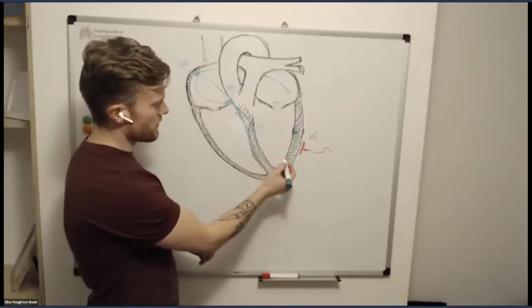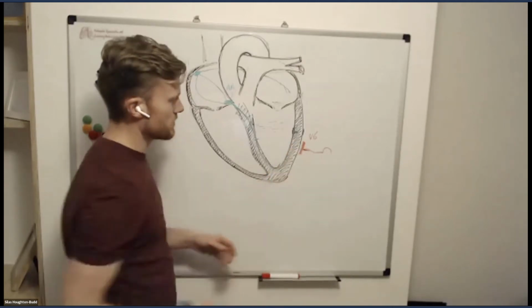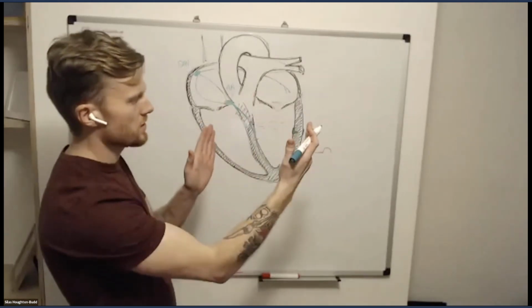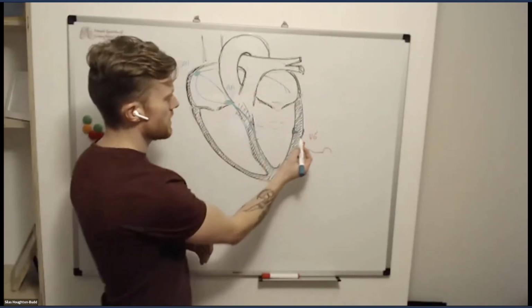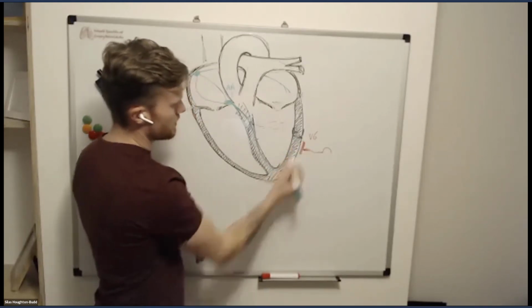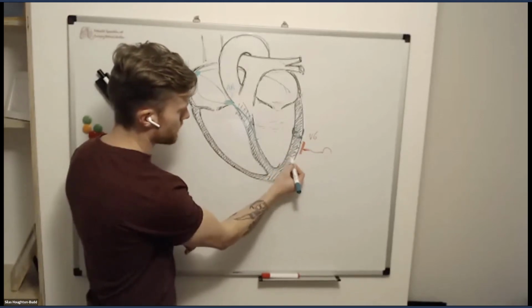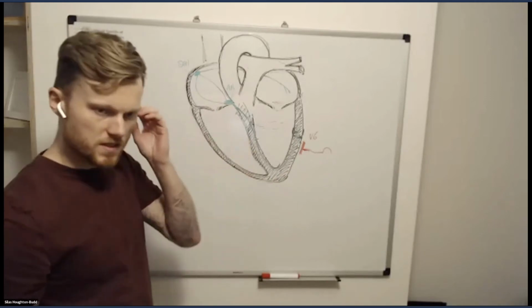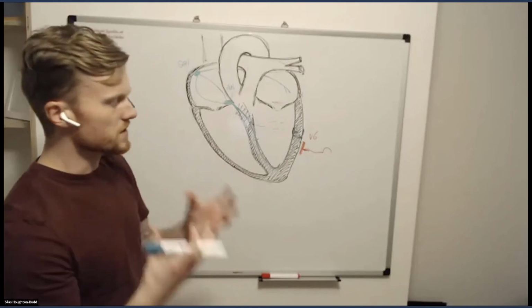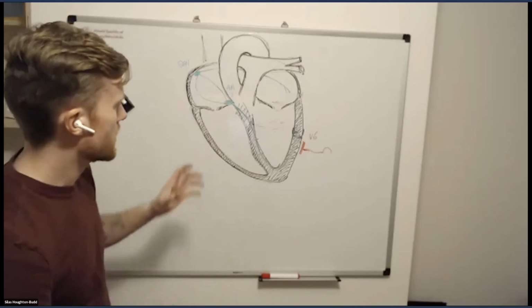And so the Purkinje fibers, like I say, innervate the inner aspect of the endocardium in normal physiology. And then that domino effect of cardiomyocytes triggering the next one to depolarize spreads from the inside of the myocardium outward. So the energy goes outward like that. And so the wave of current that we see on the ECG is from electricity flowing toward the electrodes during the depolarization phase. So if we look at the physiology of this then, this is the kind of anatomy.